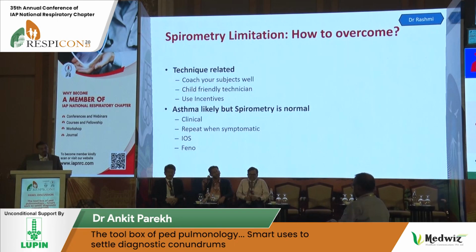For spirometry, the FEV1 and FVC are effort dependent. But there is a small part of it, the maximum mid expiratory flow rate, which is not effort dependent. Can I use that? This is not recommended in GINA. No, sir, that is a problem, because studies have shown that it may not be useful.